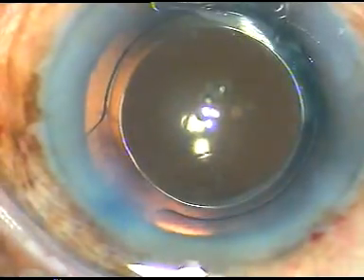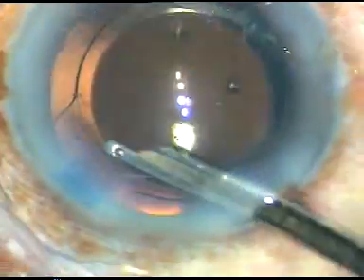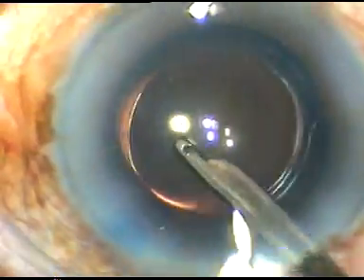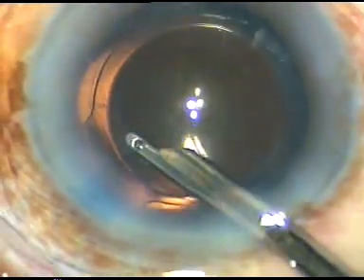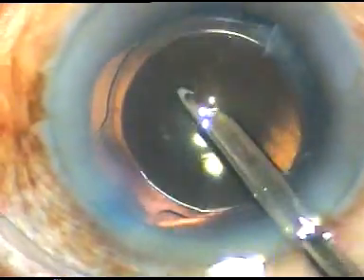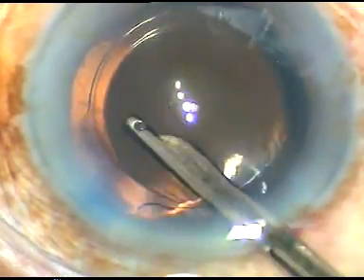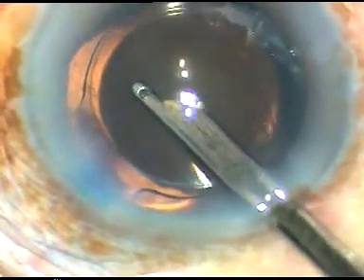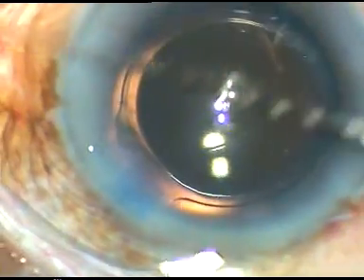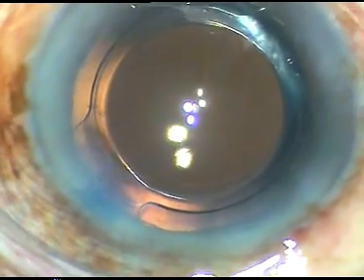So in this case I have used only irrigation to remove some cortical lens matter and reduce the intralenticular pressure. In other cases I have used a Simcoe cannula to aspirate some cortical lens matter, but in this case it was just irrigation. And in this case the anterior chamber is formed with BSS, and the case is concluded.